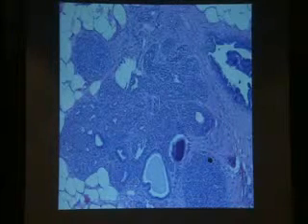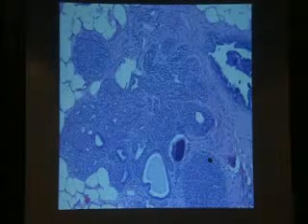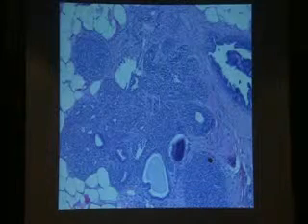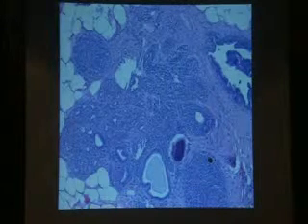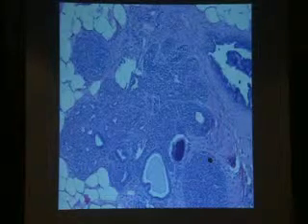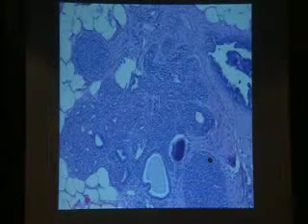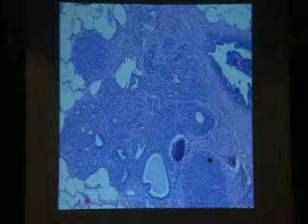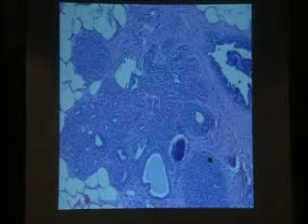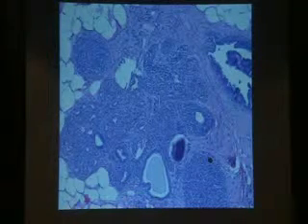When there is a low-grade intraductal carcinoma, the distinction between DCIS versus LCIS, in my opinion, can be problematic on H&E. And the only distinguishing feature that I can reliably use is the presence of lumen formation. If I do not see any lumen formation, that is more problematic when the lesion involves lobular units, then I perform immunohistochemistry for E-cadherin.